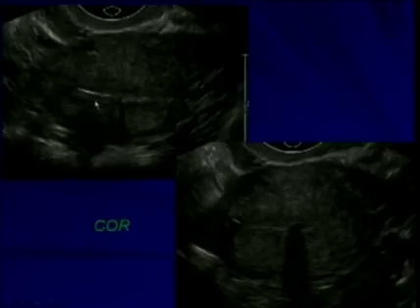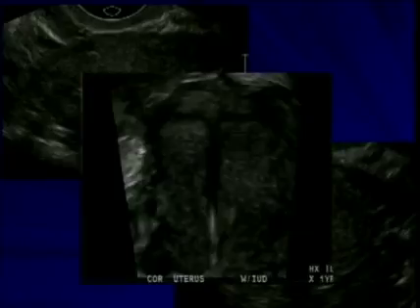Again, we have the double echo, but the other arm was not in the same plane and somewhat difficult to see, and therefore our confidence was not great that in fact we could say that the IUD was in perfect position. But again, using the shadow of the IUD to image the IUD on 3D ultrasound, we see that in fact the IUD is intact and is in a normal location. Here again is the echogenic string.